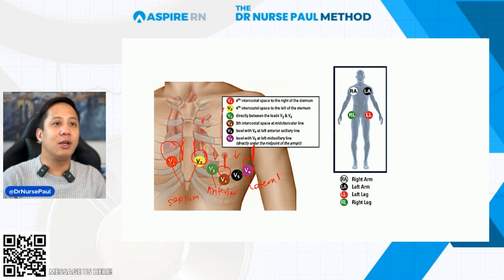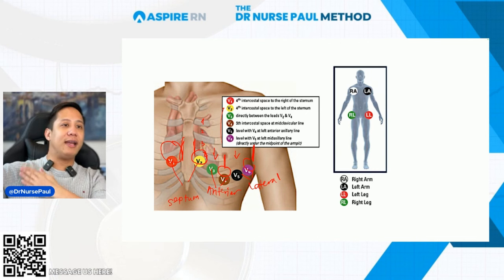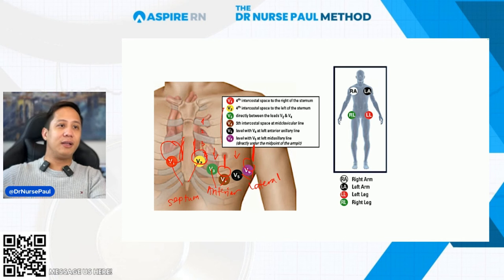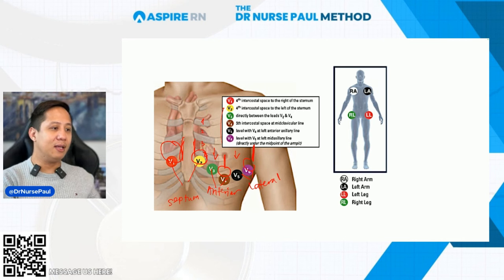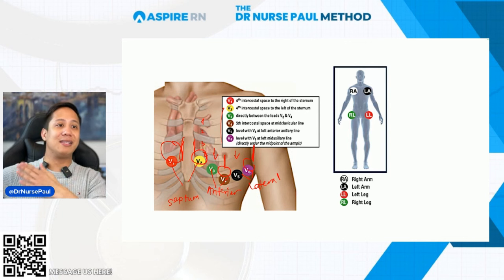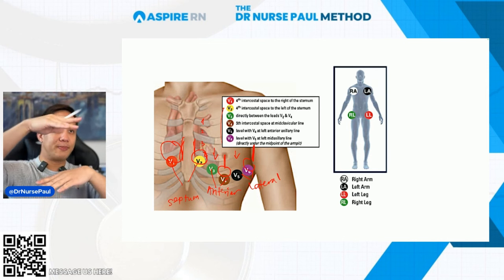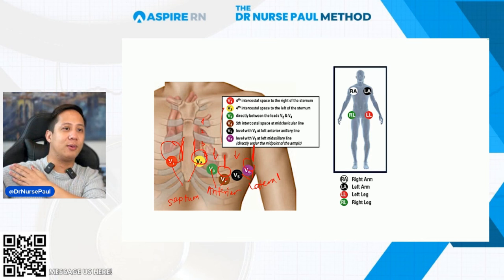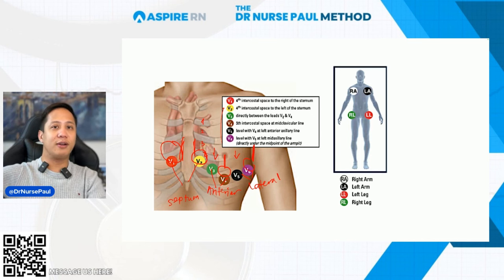All right. The way to remember it, you have white and green, black and red, right? So the way to remember it is snow over grass. You know the snow, right? When it falls, it's on the top of the grass. What's the color of the snow? White. What's the color of the grass? Green. You got it? Snow over grass.